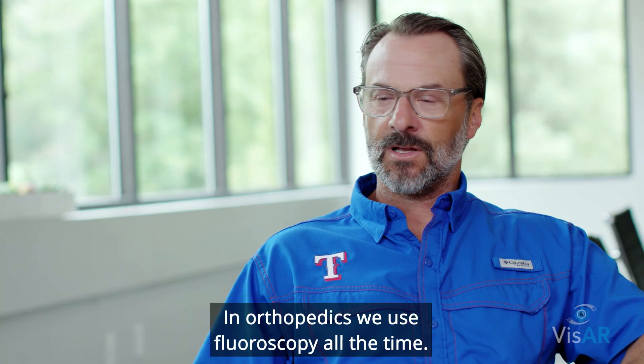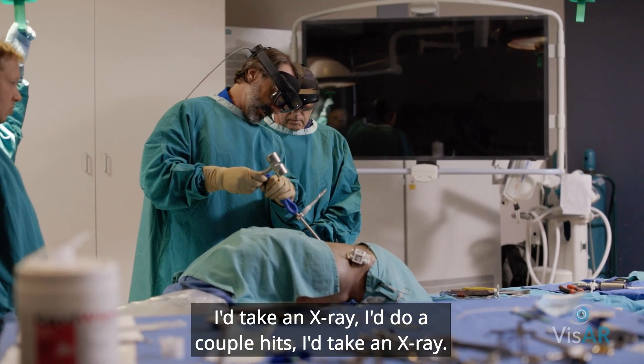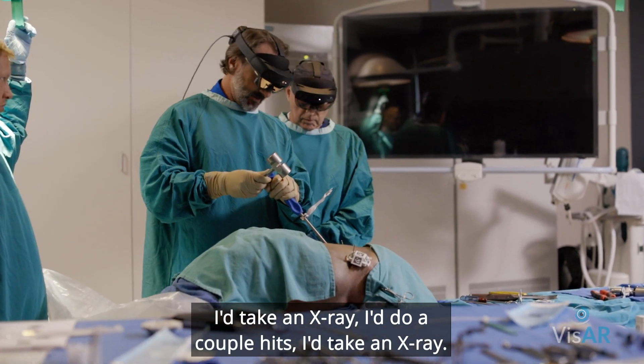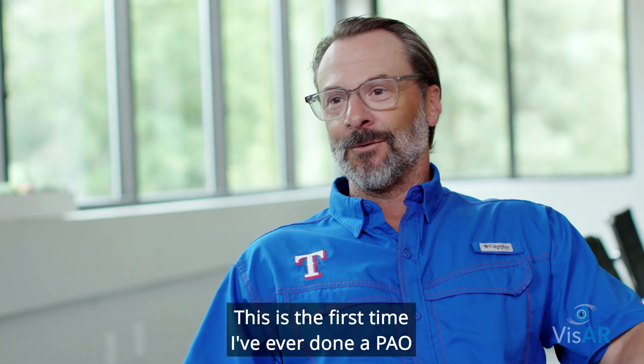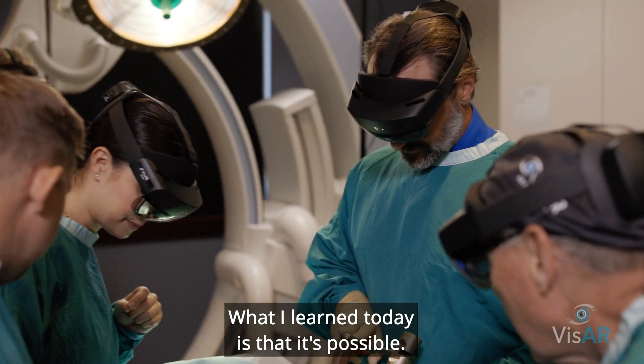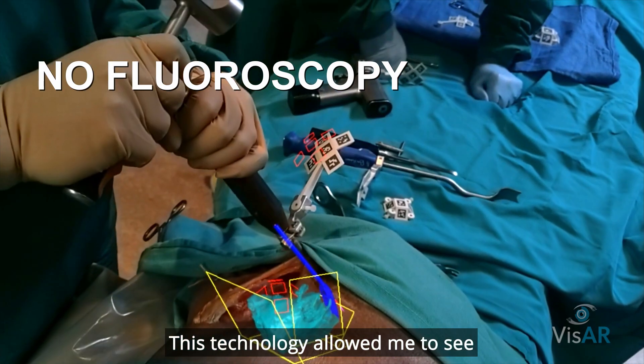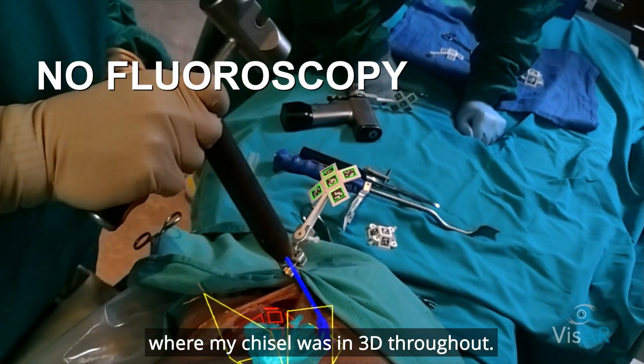In orthopedics, we use fluoroscopy all the time. Normally with x-ray, I take a couple hits, I take an x-ray, do a couple hits, take another x-ray. This is the first time I've ever done a PAO without any fluoro. What I learned today is that it's possible. This technology allowed me to see where my chisel was in 3D throughout.